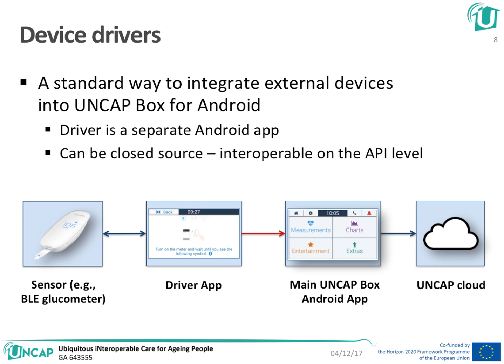It can be closed source, which means it's interoperable on the API level and can be provided by the device vendor. In this picture, you see a glucometer, and this glucometer is paired with a driver which understands it, and both can be provided by the same company.